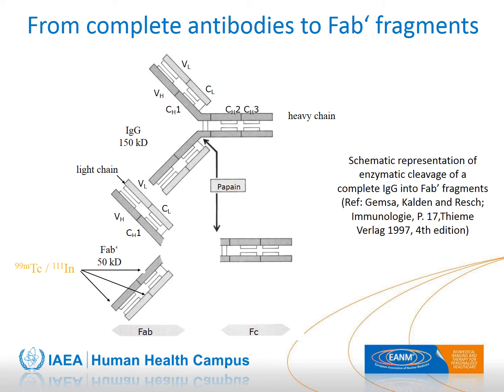When one cannot label the WBCs themselves, we can then target the WBCs through antibodies to them, often mouse-related antibodies to human white blood cell are used, and these can vary from the complete antibody in its Y tuning fork shaped structure to FAB fragments, which are the prongs of the tuning fork broken down by papain, and then labeled to either technetium or indium.